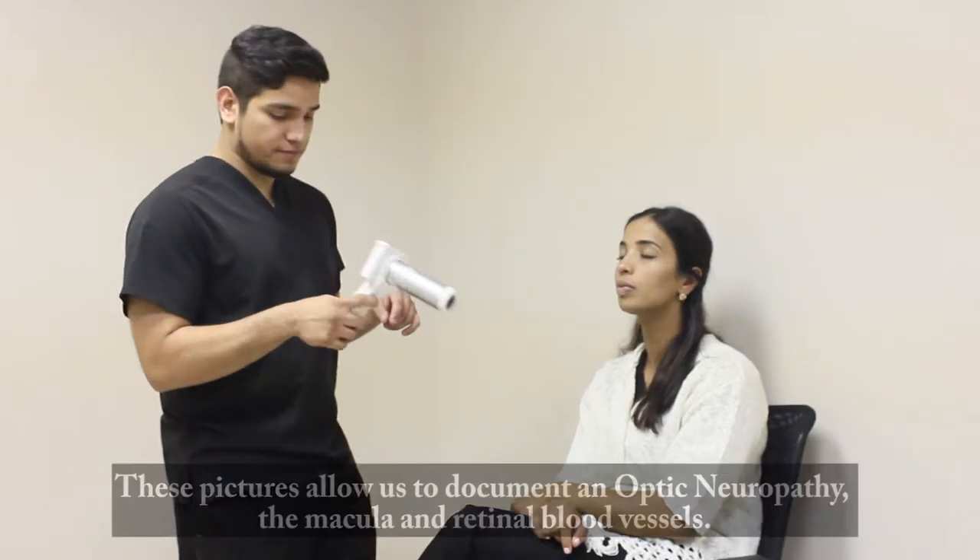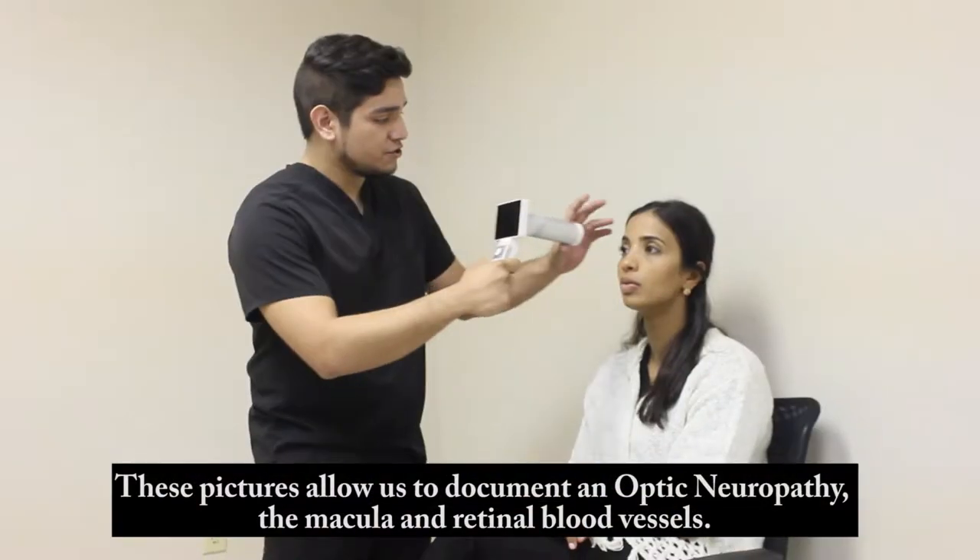We're going to be doing a fundus photo, just a general picture of the back of the eye, like of your optic nerve and your macula. All I need you to do is look straight ahead for me — it's going to be a bright flash in just a moment.